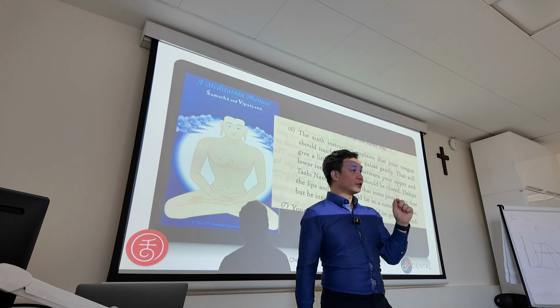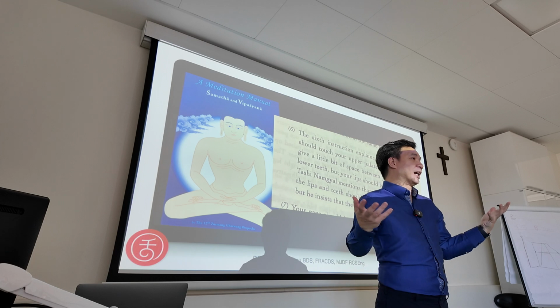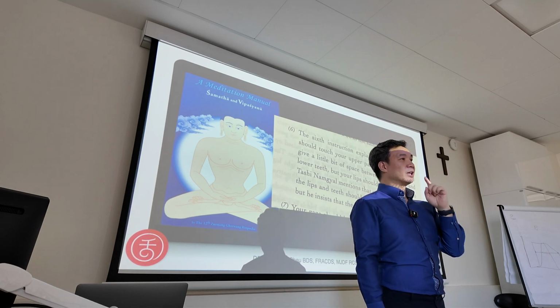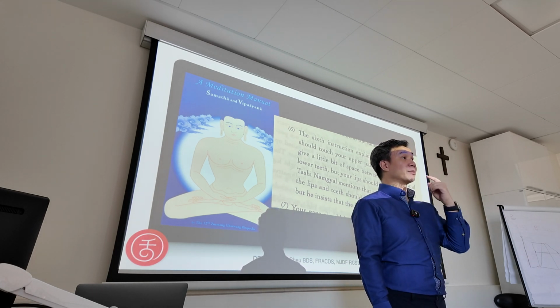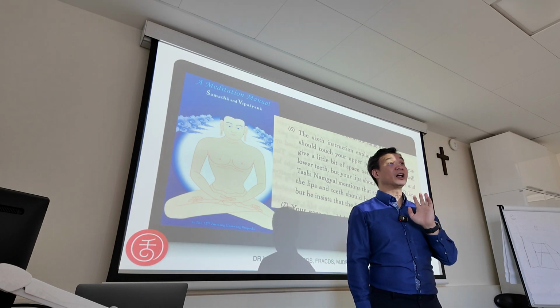And if you are able to give them something like a myo spot again, or I've tried other ways, but it's not easy. So with the myo spot, brace against it, and sometimes I can demonstrate with my mouth open. I do this, tongue up against the area, and swallow.